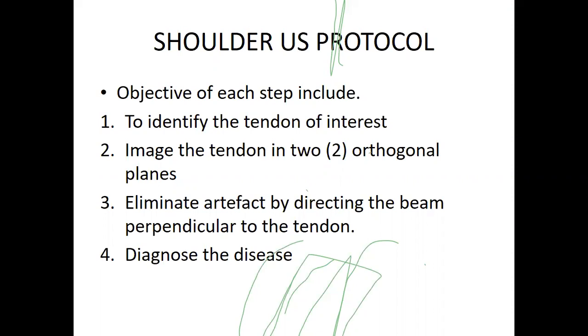One, to identify the tendon of interest and its related pathologies. Image the tendon at two orthogonal planes, transverse and sagittal. Transverse, sagittal. We'll keep mentioning this. We understand the importance of these views.